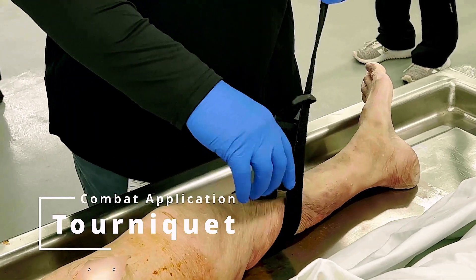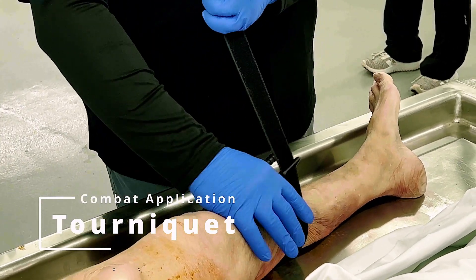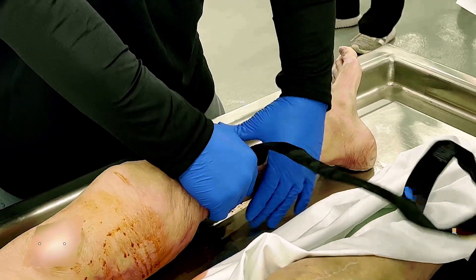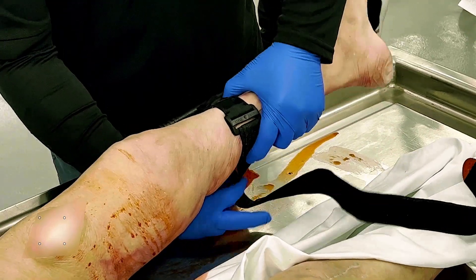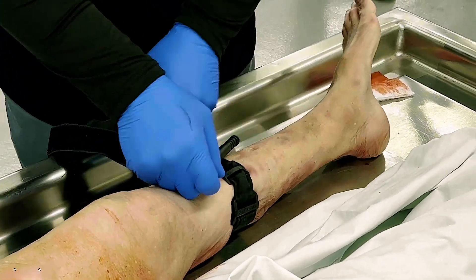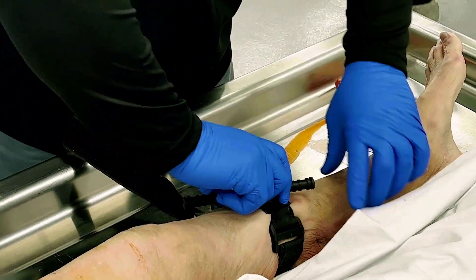Welcome to the demonstration on how to apply a combat application tourniquet, or CAT. The combat tourniquet is a life-saving device used to control bleeding in the extremities. It is a critical tool when bleeding cannot be controlled with direct pressure alone. Let's go through the steps of applying the combat tourniquet.